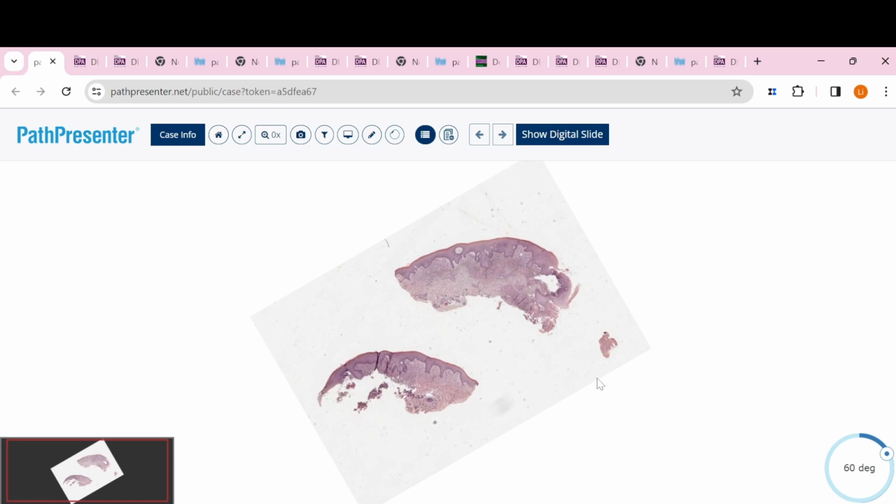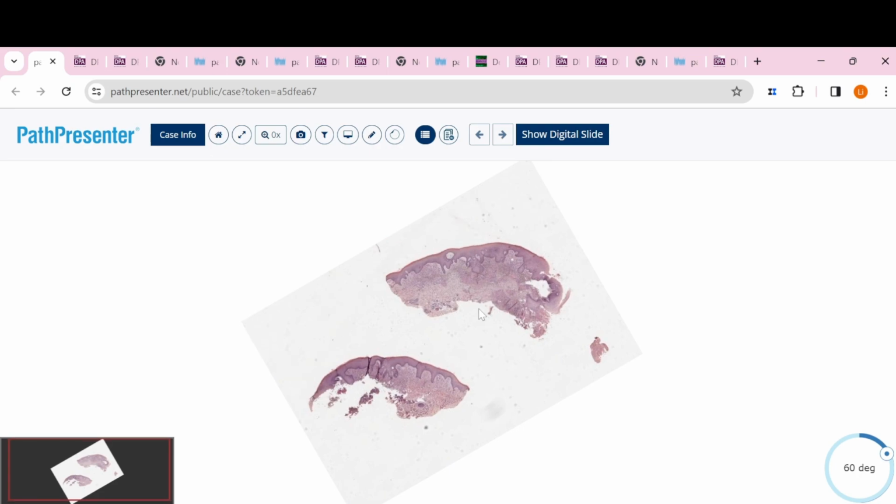Usually it happens in the lower leg, especially in the anterior area. What we can see in the slide, usually these stasis changes are due to hypoxia. That means the skin of the lower leg does not have enough oxygen. So the pathologic changes will cause reactive epidermal hyperplasia. And then usually people will feel kind of itching in the lower leg. So you can see a little bit of acanthosis here. That means the epidermis is kind of thicker.